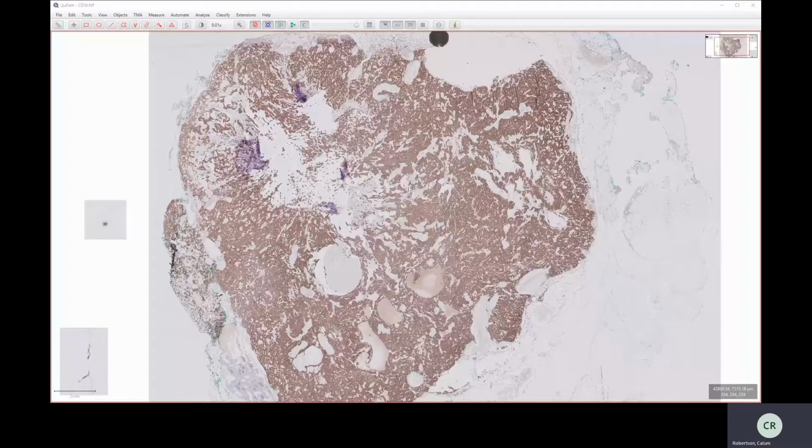Another use is subtyping malignancy. So we might know, for example, this is a testis tumor. We're in the testis. But subtyping those based on morphology is sometimes a bit tricky. And we can use a panel of immunohistochemistry with different antibodies. Based on the staining pattern within that panel, we can narrow down the diagnosis to a specific subtype of testicular carcinoma or testicular cancer.